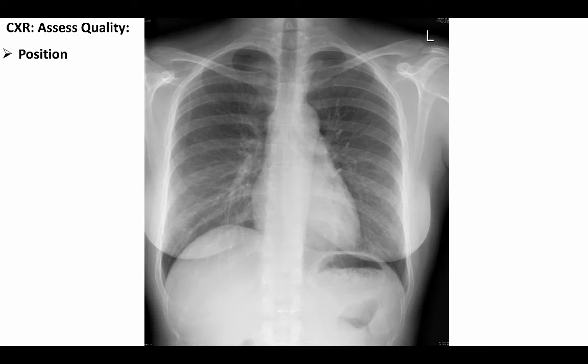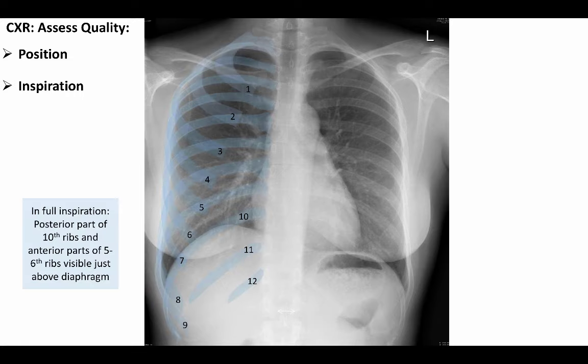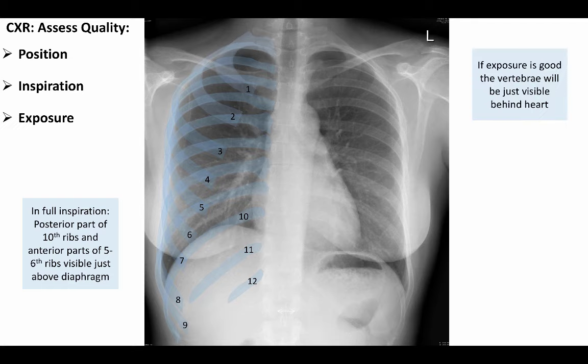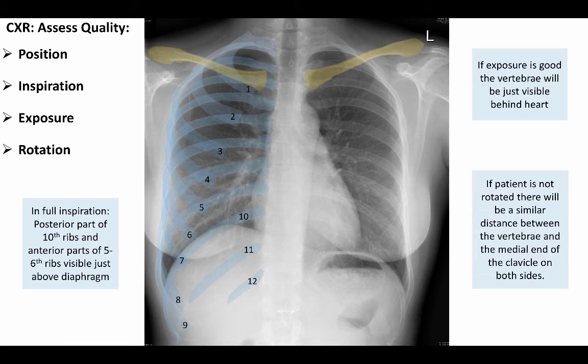We also examine if the patient has taken an adequately deep inspiration. If this is the case, the posterior aspects of the 10th ribs and the anterior aspects of the 5th or 6th ribs should be visible above the diaphragm. If the correct exposure was used, the vertebrae should be visible just behind the heart. To assess rotation of the patient, we observe the medial ends of the clavicles, which should be equidistant from the midline of the patient.